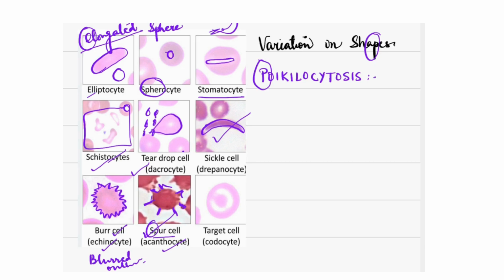Okay. And again there is a target cell. Target cell, very common in iron deficiency anemia and thalassemia. It's very important. If you see those, report it. It might help the physician to get the diagnosis right. And what is the target cell? It's like a bullseye, that dart game you played when you were a kid.